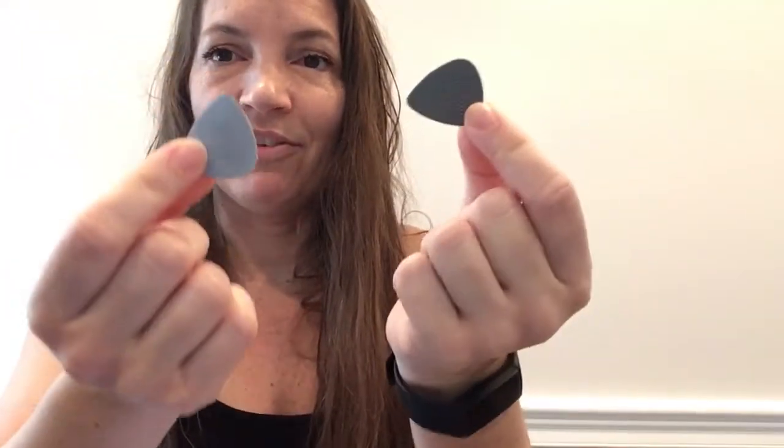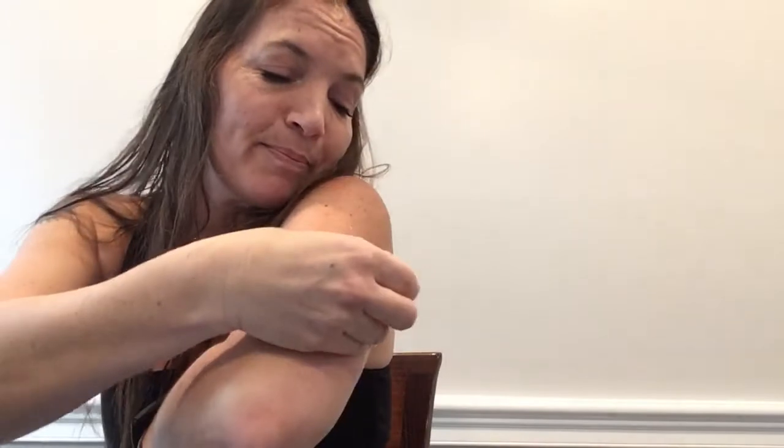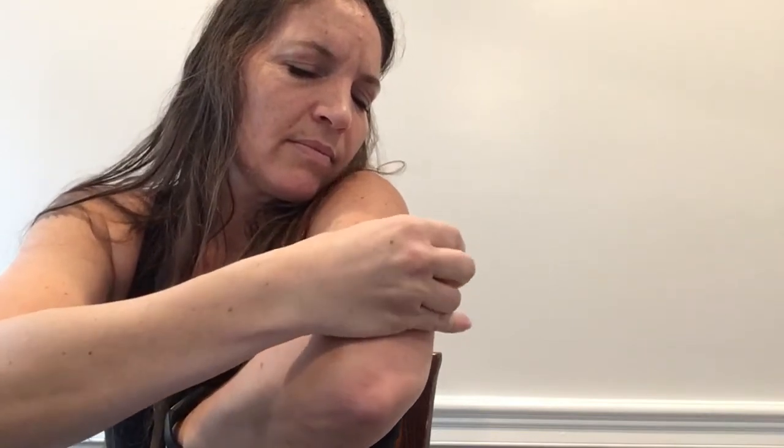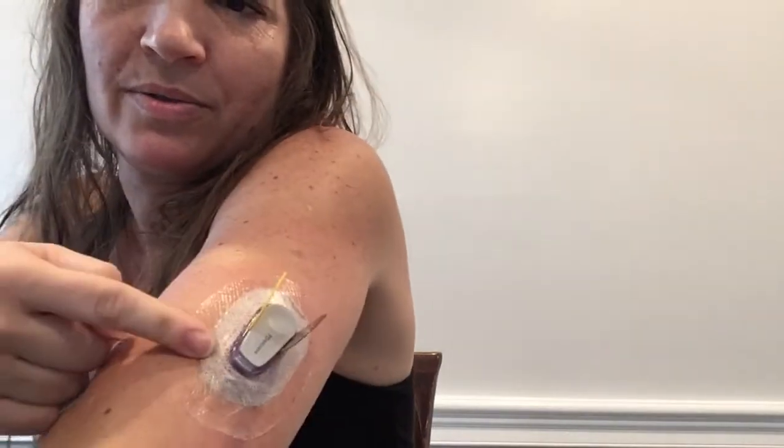As suggested, I did purchase guitar picks off of Amazon. It was an assortment — there's a whole bunch of different thicknesses. I don't know which one is which, I just grabbed two and I hope this works. People do it with test strips. I have a really hard time doing it by myself with test strips, but I have found that jamming — I know someone's going to freak out about it and say you're not supposed to do that.